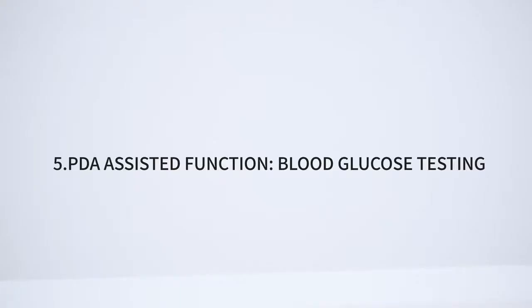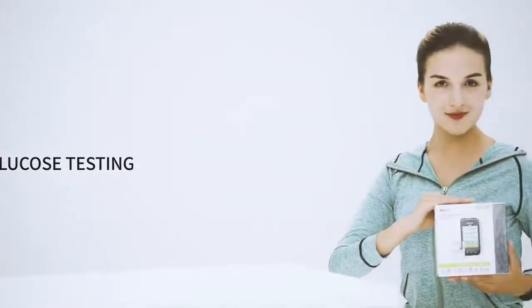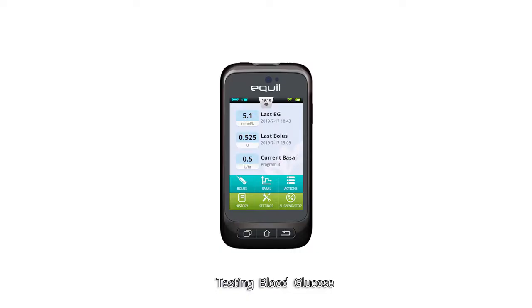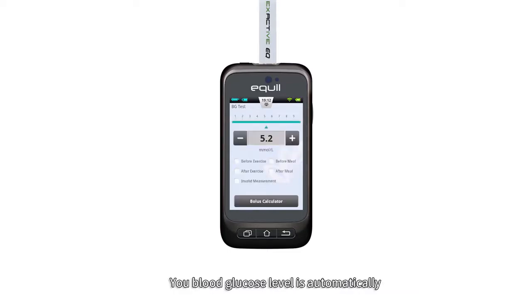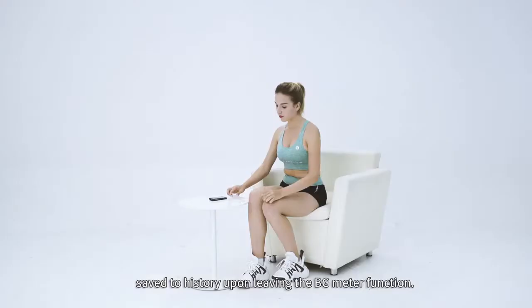5. PDA assisted function. Testing blood glucose. If the display is on, insert an Exactive EQ test strip and the blood glucose meter screen will appear. Measuring blood glucose is the same as the usual method. Your blood glucose level is automatically saved to history upon leaving the BG meter function.